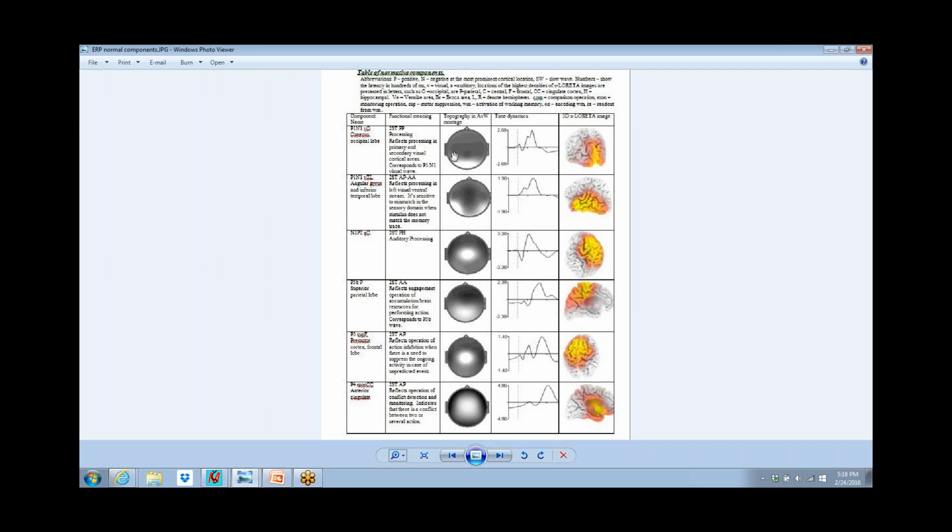The ERP basically ends up identifying step by step how the brain is processing the signal and the motor responses and the comparison to recollection of the instruction sets. This gives us a great deal of detail about the response.